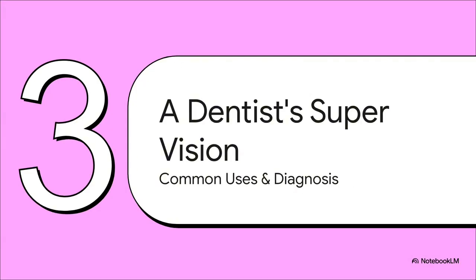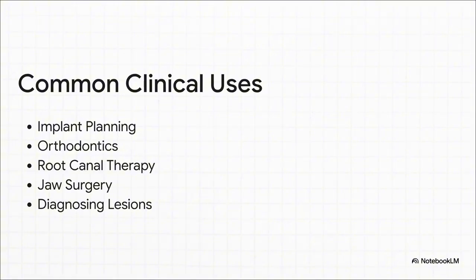Okay, so we've got this incredible 3D model. Now what? What does your dentist actually do with it? Well, this is where it gets really interesting. This is where the tech goes from just being cool to being absolutely critical. It basically gives your dentist superpowers. Seriously, this is a total game changer for so many things in dentistry.